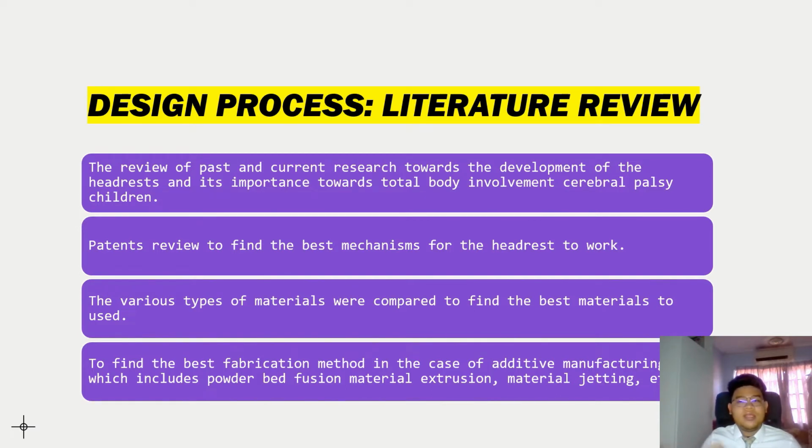And then I wanted to find the best fabrication method in the case of additive manufacturing, which includes powder bed fusion, material extrusion, material jetting, etc. Material extrusion is basically FDM.